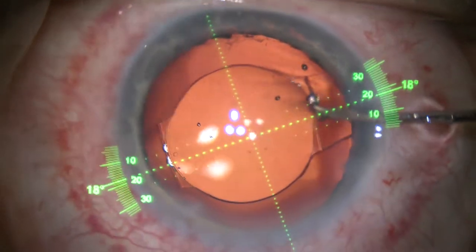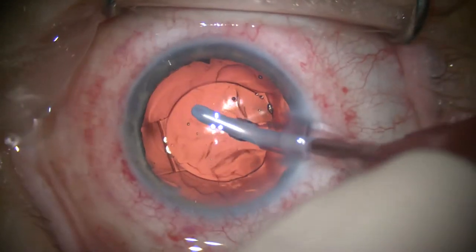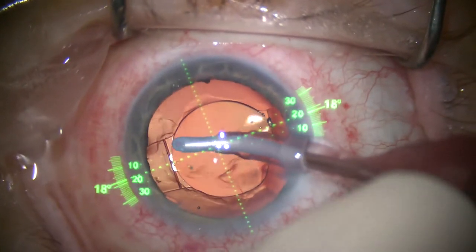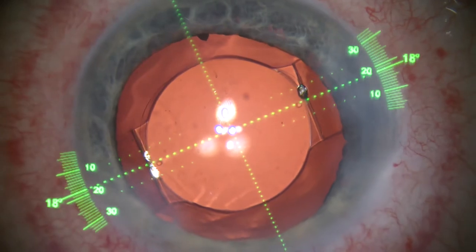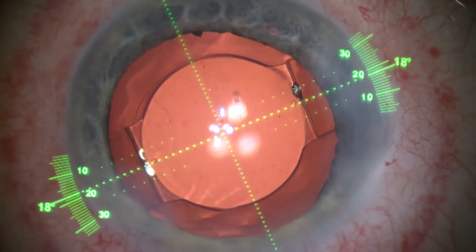With the crystal lens, we can rotate counterclockwise or clockwise easily and the lens stays in its position. In fact, when we remove the viscoelastic, we are able to see that the crystal lens maintains its position due to the four-point fixation and does not rotate out of position.